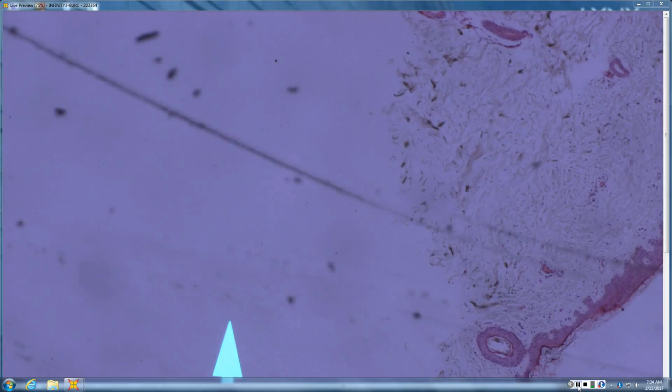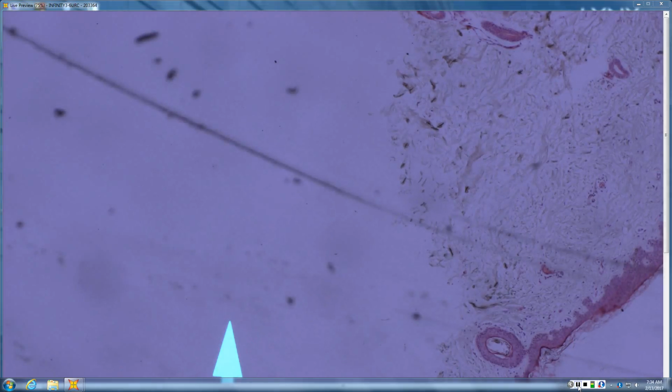Is that a melanoma? Yeah. That was melanoma. That's a hard one. That was weird. Well, it's a little different, but melanomas have all sorts of different patterns. In that one, you had a highly malignant cell population with visible cytoplasm and a rhabdoid cytoplasm. So rhabdoid doesn't mean muscle. Rhabdoid means oid, so it's mimicking what muscle tumors do. But it's not a muscle tumor.